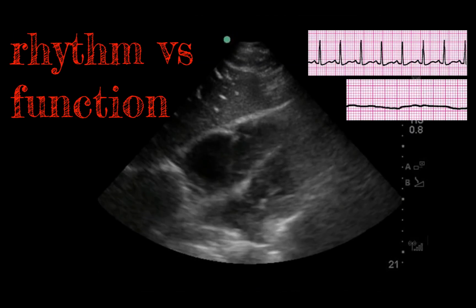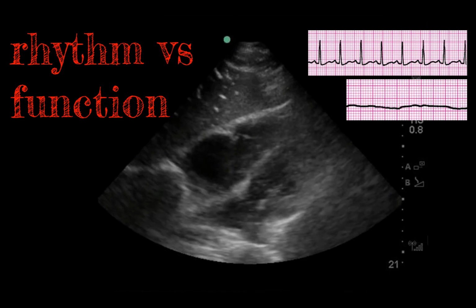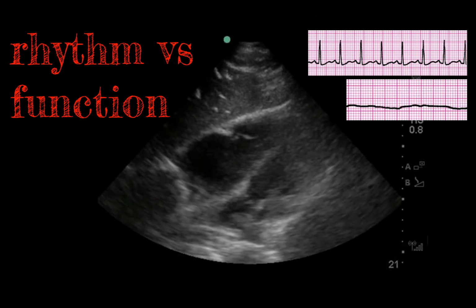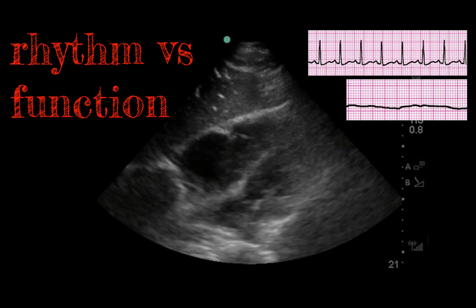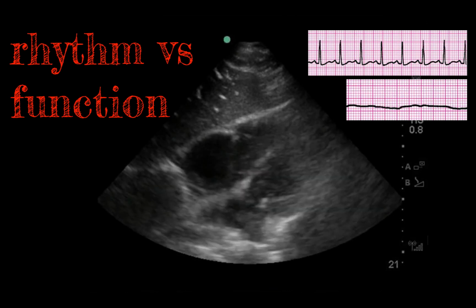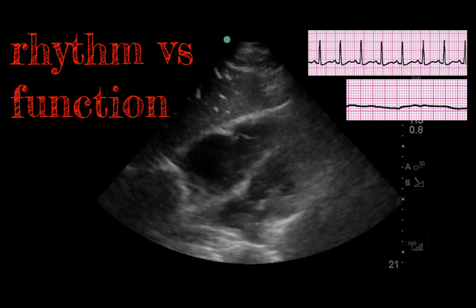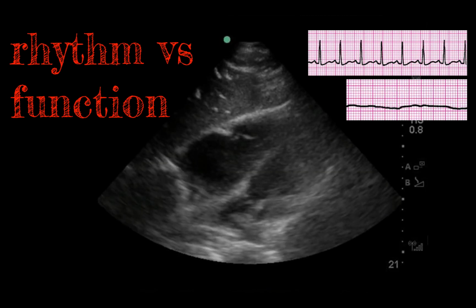Another example of this kind of difference between the electrical and mechanical rhythms is the case of the heart with some but very poor activity, which can happen in both PEA and in asystole. In this case, there is some synchronized activity, but the patient doesn't have a palpable pulse. The best way to assess this kind of poor activity for now is to eyeball how well the myocardial contractions are able to make the chamber size smaller.